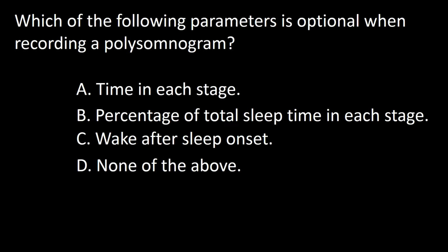Next question. Which of the following parameters is optional when recording a polysomnogram? A. Time in each stage. B. Percentage of total sleep time in each stage. C. Wake after sleep onset. D. None of the above.